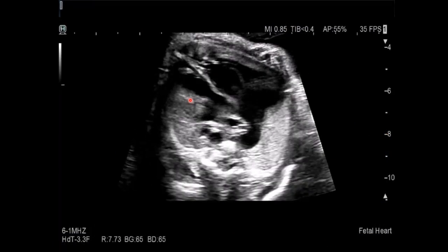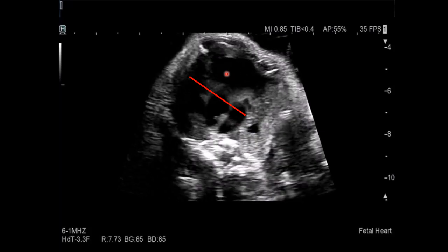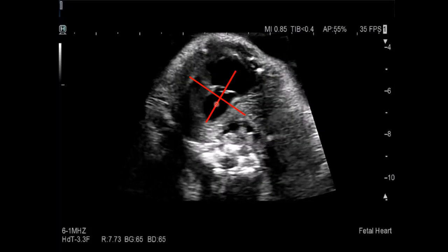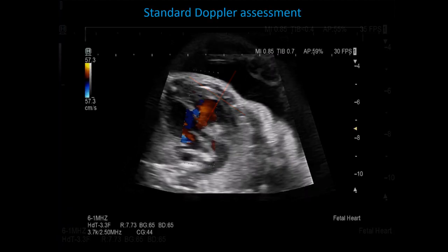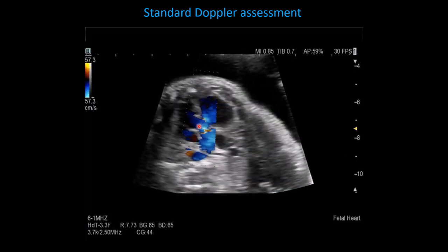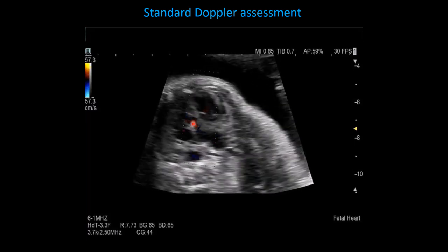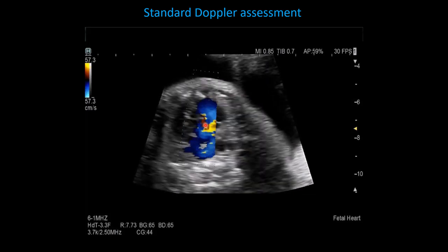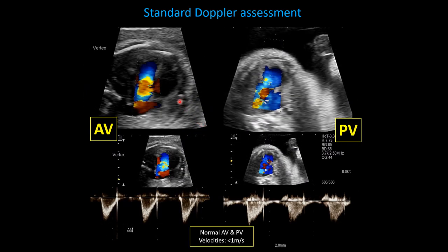The outflow tracts are next. The LV outflow tract and RV outflow tract are at opposite angles. The RV outflow tract, at the end of the sweep, is almost in plane with the plane of insonation. You want to align these flows in plane with the plane of insonation. The RV outflow tract and pulmonary valve are in plane on the right, while the LV outflow tract is aligned on the left, giving normal-appearing tracings.